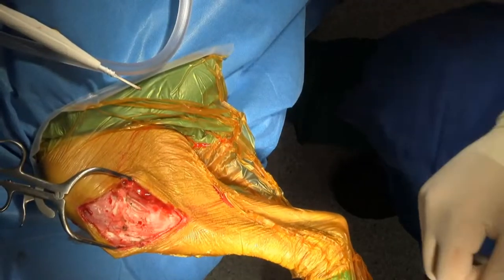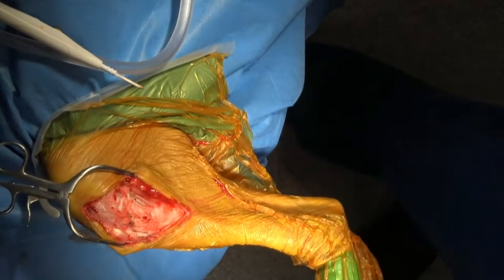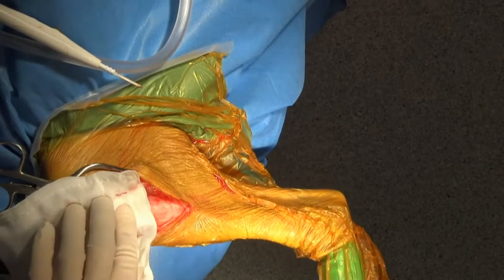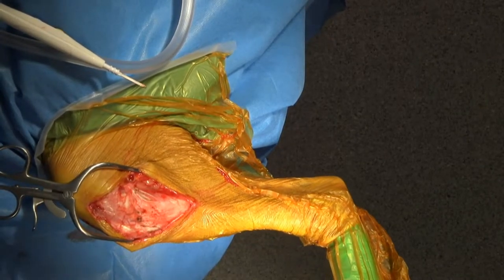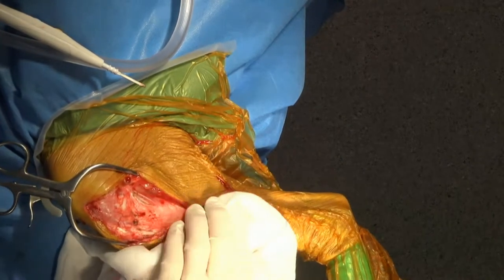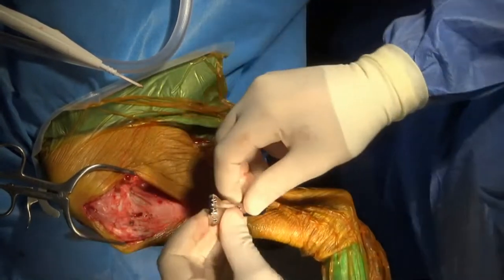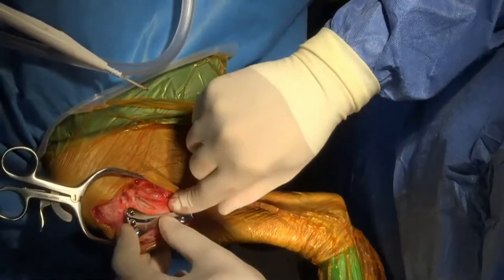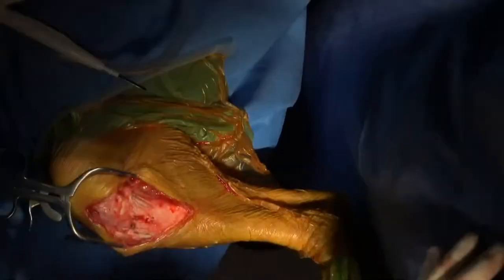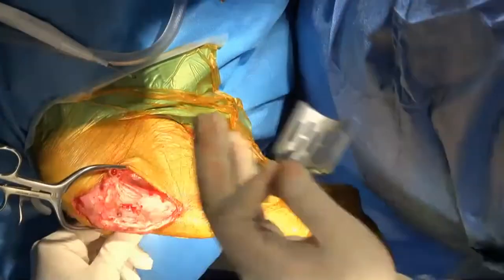Before we start cutting, I'm just going to triple check that our plate's going to work. Can I get a right CBLO plate, please? As you guys know, if you have any questions, feel free to sing out. Seems pretty quiet on the chat now. Charles is gone. 3-5, correct. Okay, so I think that's going to sit in there pretty well. As long as Ewan's happy, I'm happy. He's far more judgmental than I am about my surgical ability.